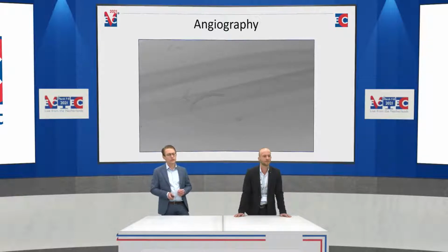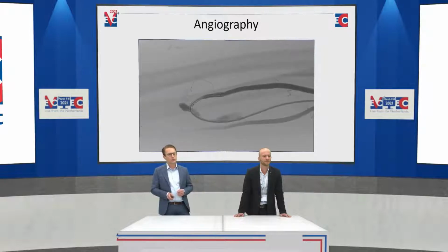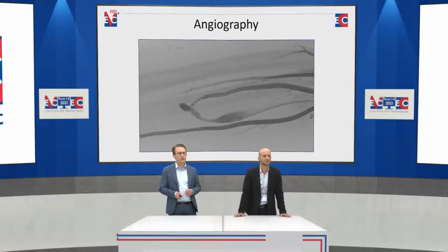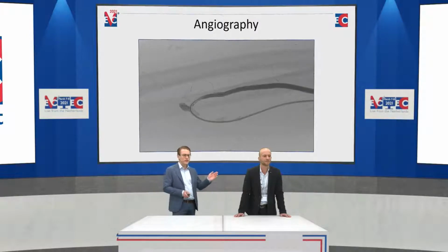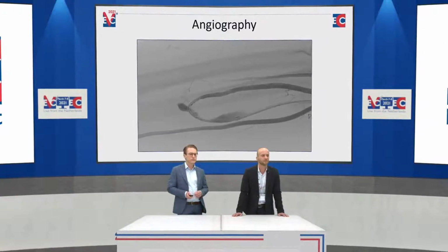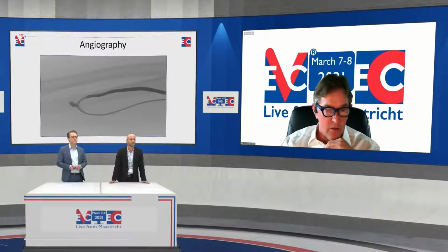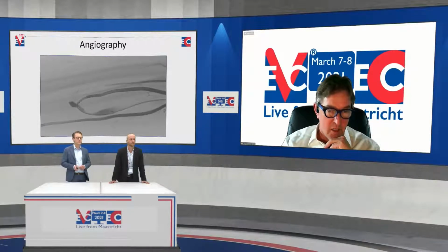We cannulated the vein in a retrograde fashion and put a catheter around the anastomosis inside the radial artery, and we made a first angiography. So maybe, Dr. van den Berg, could you comment on what you see here in this angiography image? It's a little bit difficult for me to understand exactly where the stenosis is, but I guess the stenosis is just after the anastomosis.